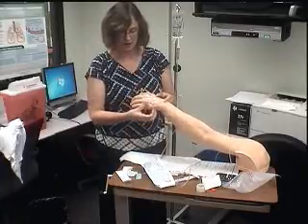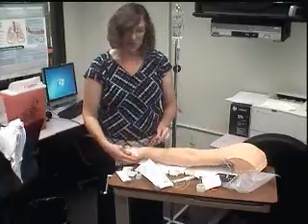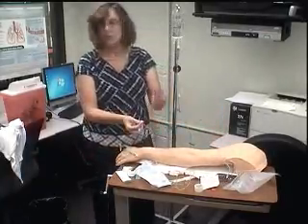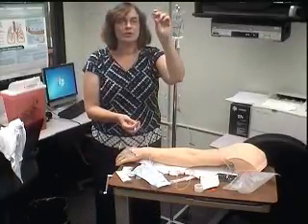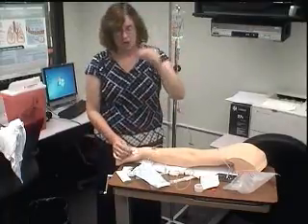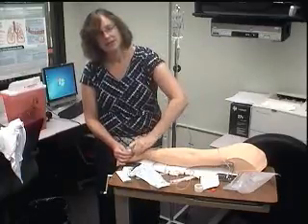So here's the lock. It's already been flushed, it's already been primed, but I've been touching it, making it dirty and germy. So I need to open one of these containers. These are the little things that you clean it with, okay? So I'm going to scrub the hub. So take this in here and scrub it.